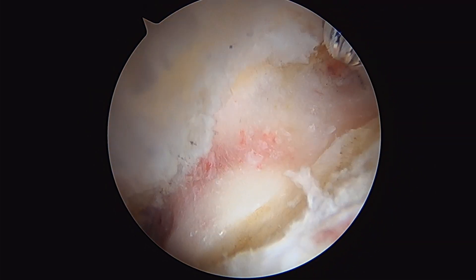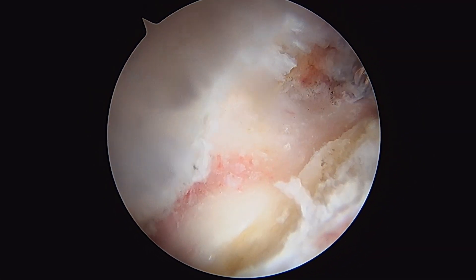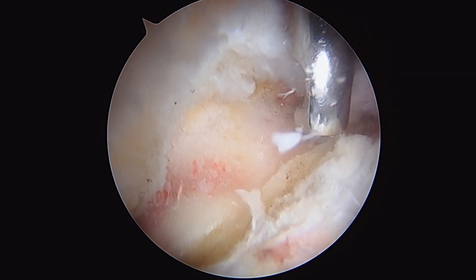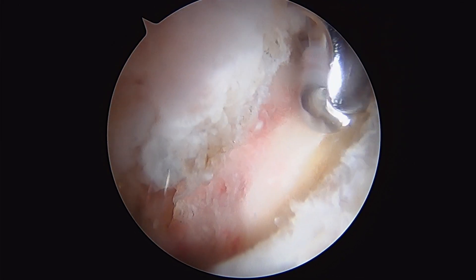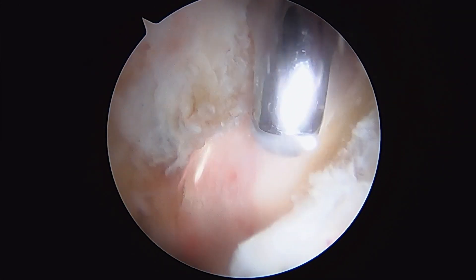That's a decent look at our finishing touches and final product. So that's an acetabularplasty. Now we're going to work on fixing the labrum for our acetabular labral repair.